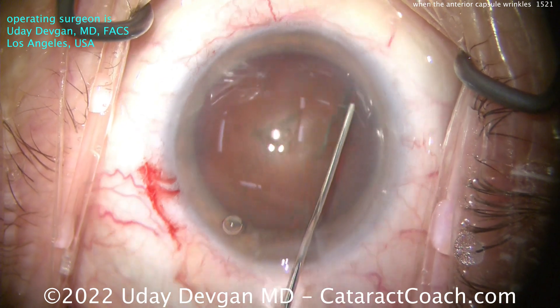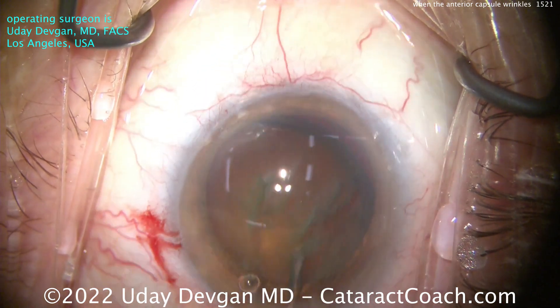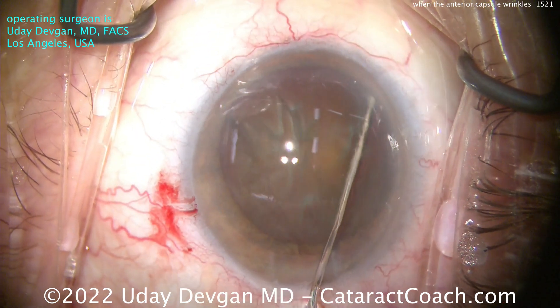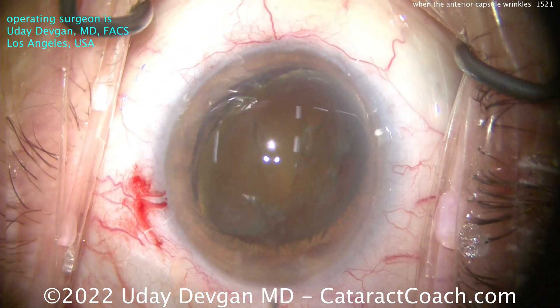Do some hydrodissection, nice and careful. I'm looking for that fluid wave to go across the back, and we'll see how this lens presents. We'll be able to take it as it comes. If I can get it out of the capsule bag, that's going to make life a lot easier. And there you go.